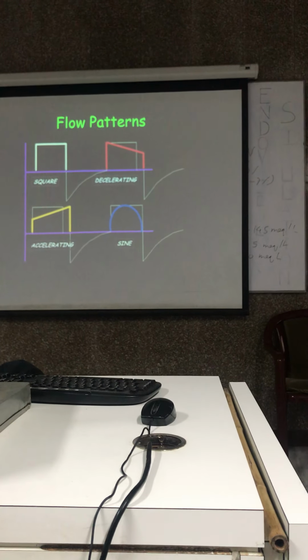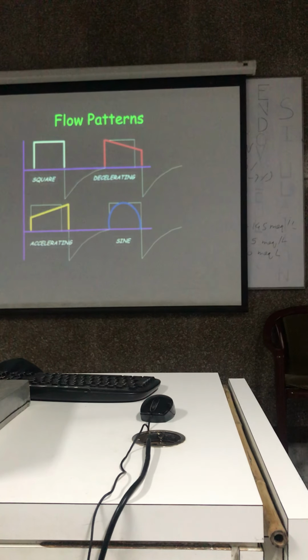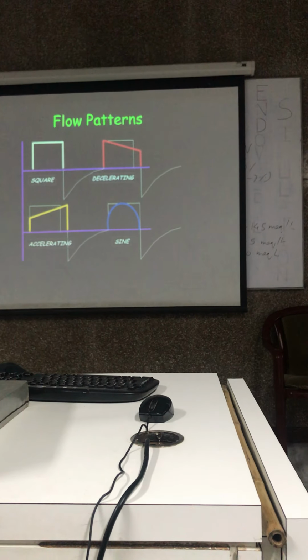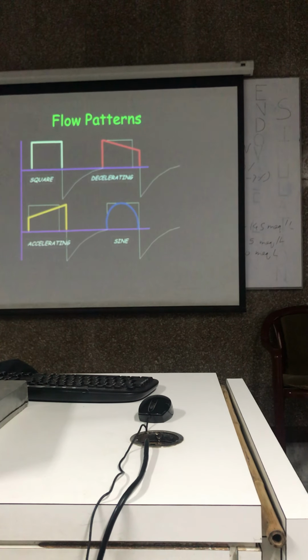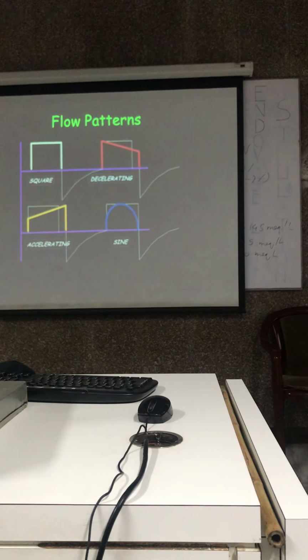That is like in the servo ventilators, it is time cycle. And the shorter the time you keep, the faster the flow gets. So the flow is determined by the time that you keep. So ventilator manufacturers alter this, so that each of these manufacturers gives you a different form of flow.